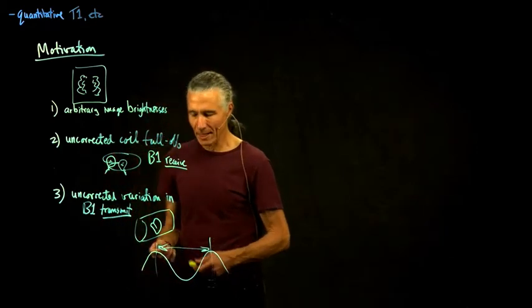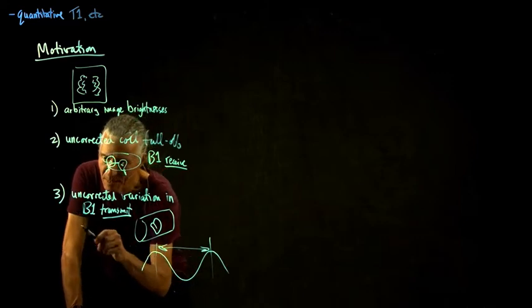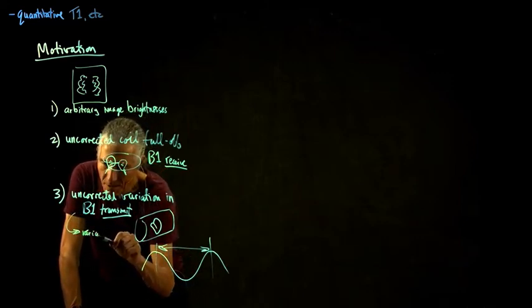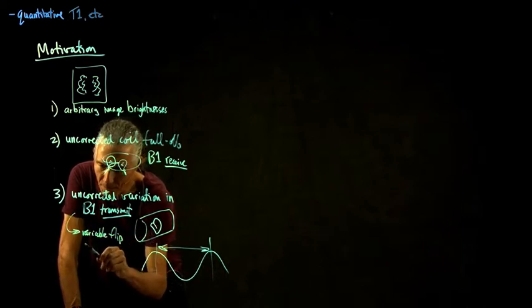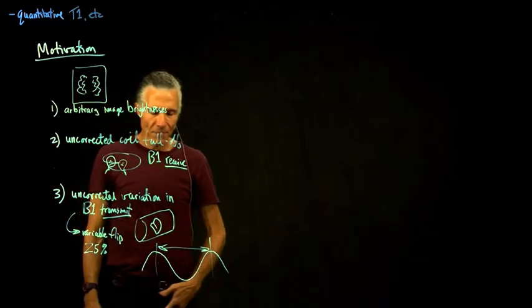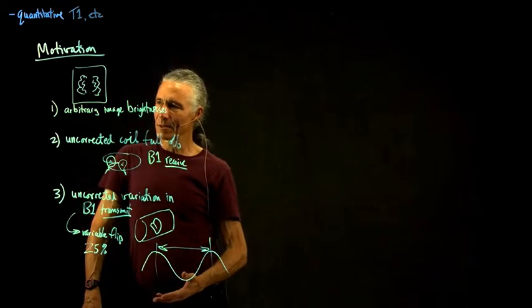So unfortunately, that results in variable flip angle. And how much does that vary? It could vary by like 25%. So that means, like you said that you put in a 90, but instead you got like 120 or 115.